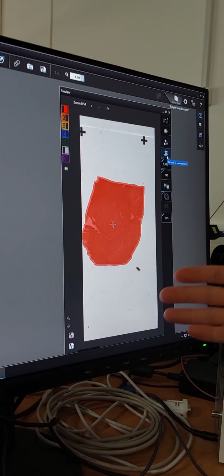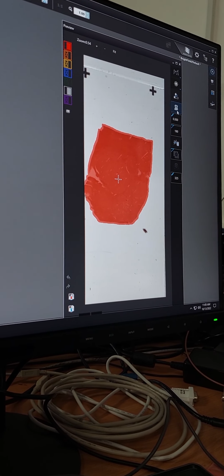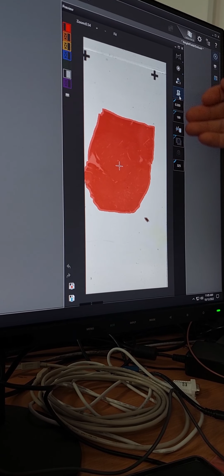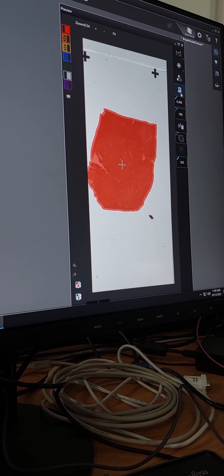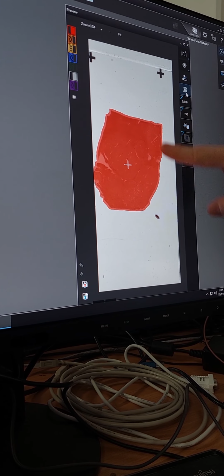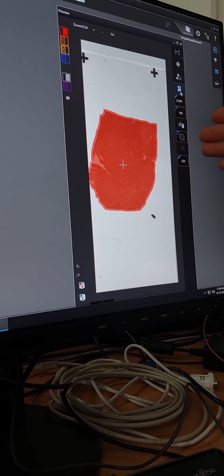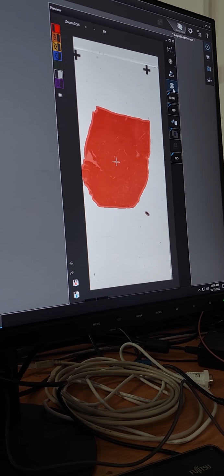Okay. So if you have samples like this on your slides, 12 slides preloaded, but of course they are always in a different location, you can save these threshold settings to the imaging profile. So every time a slide is loaded in and the bright field preview is taken, it is always going to be your tissue sample that is imaged, because the tissue is quite the same. The applied threshold will be very good to separate the tissue for scanning.